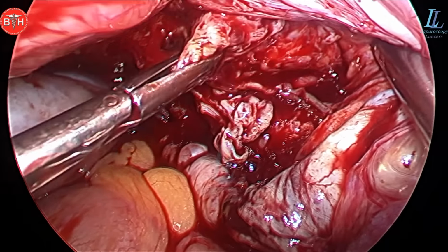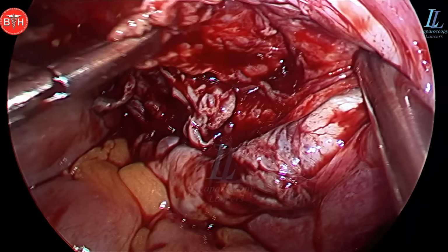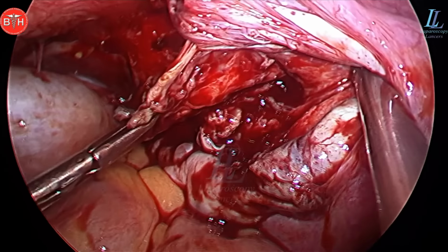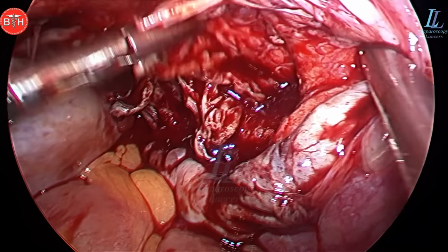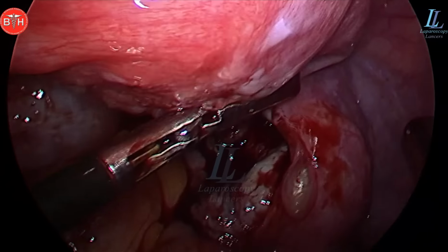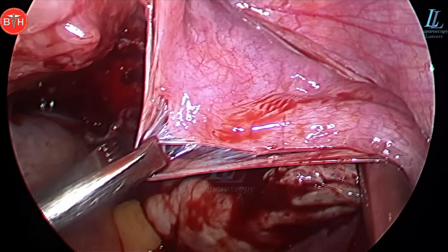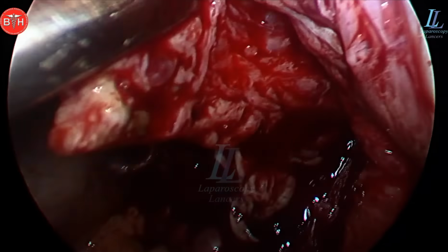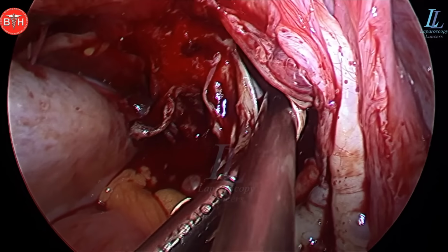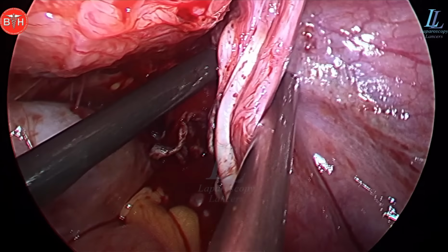So endometriosis is a chronic condition, meaning there is no known way to permanently eliminate it. However, various treatments can help, as we are doing in this case. This is for treatment of infertility in particular and relieving the pain. The pain relievers over the counter like Combiflam, Dolo, and Aceclofenac, any pain relief medicines can manage pain and discomfort during the period. Then there you can see a window that is formed over here.